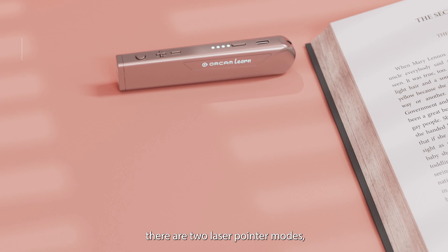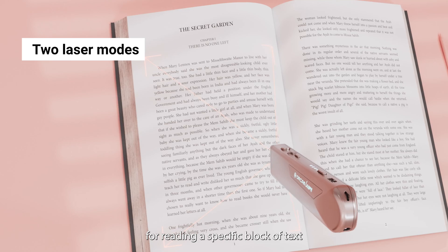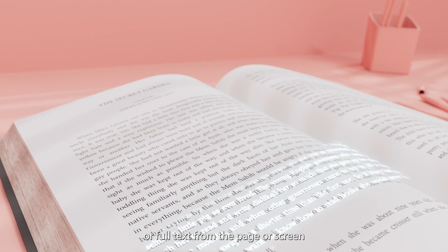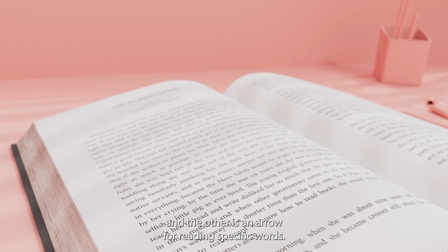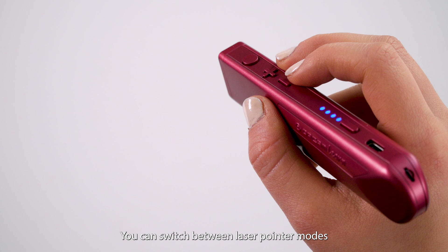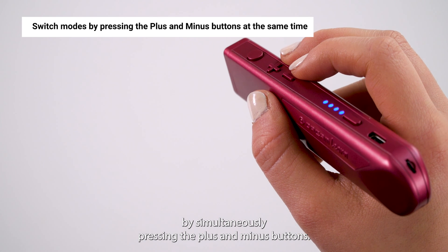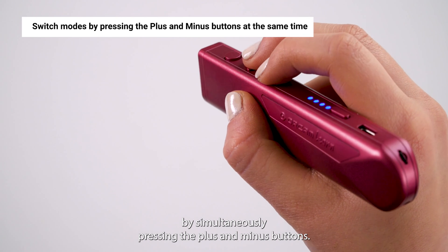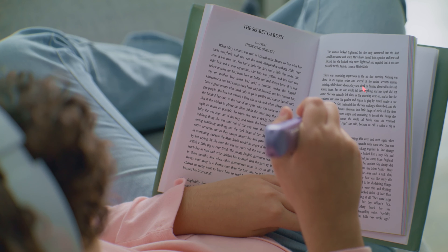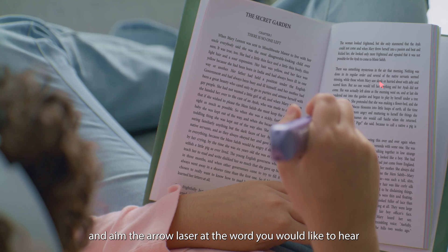There are two laser pointer modes. One is the rectangular frame for reading a specific block of text, or full text from a page or screen. The other is an arrow for reading specific words. You can switch between laser pointer modes by simultaneously pressing the plus and minus buttons. To read a specific word, long press the trigger button and aim the arrow laser at the word you would like to hear.